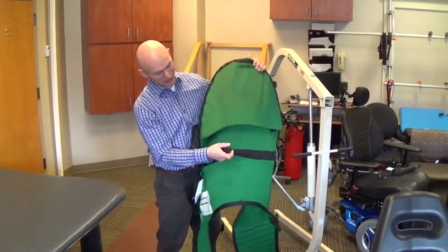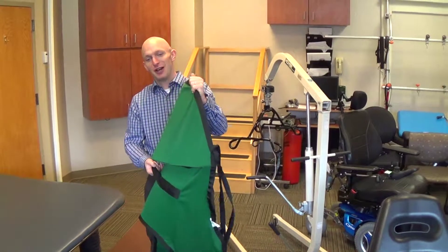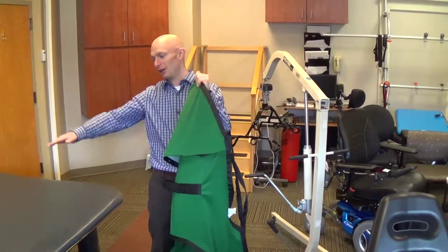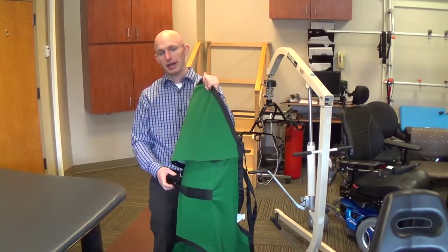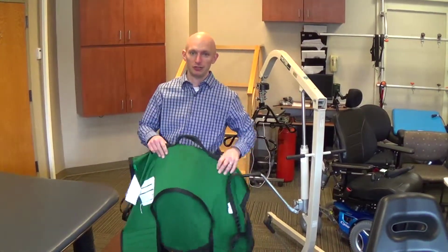There's also typically a handle on the back that can be used to pull the patient back into the wheelchair or align them on the bed. And those are the components of a hydraulic patient lifter and a sling.